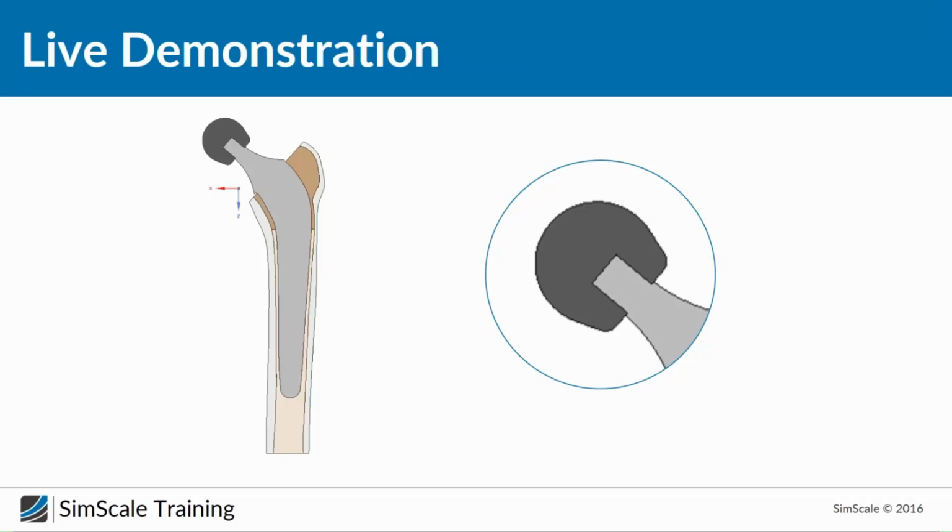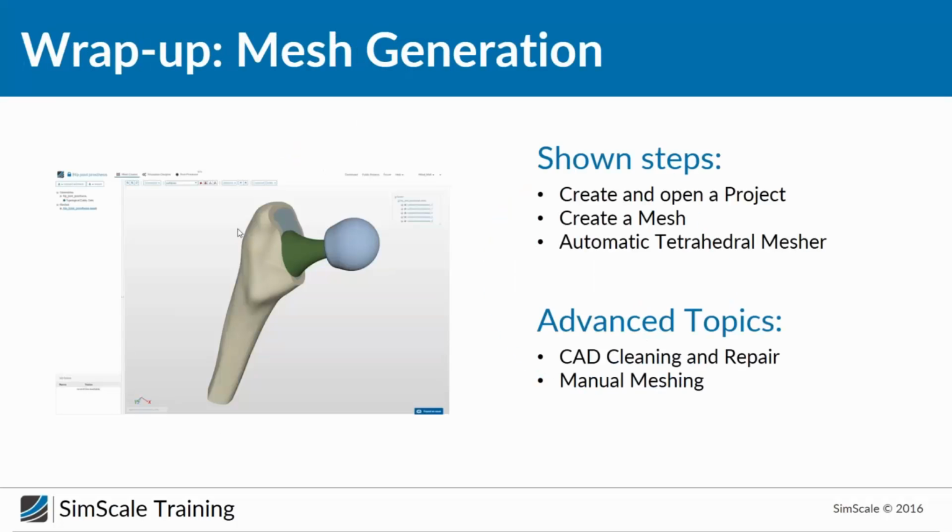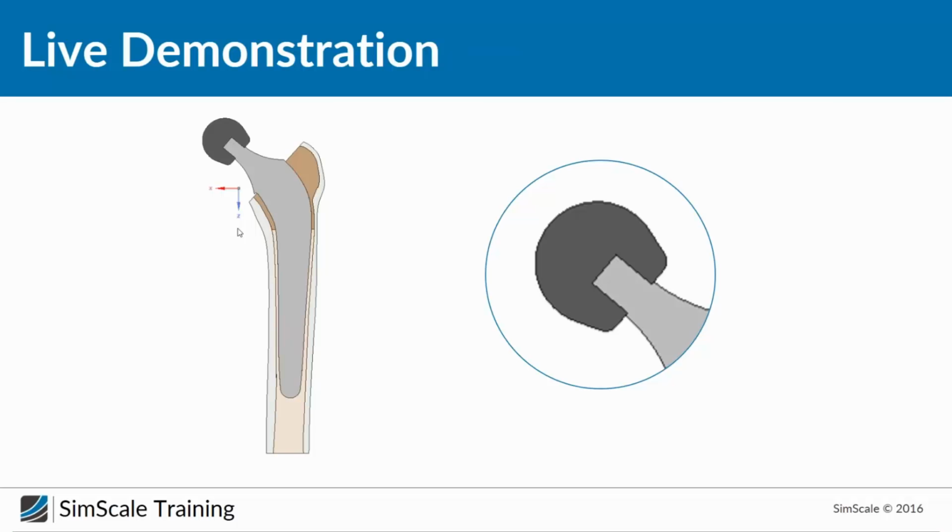Most of the cases not. For example, for all these contacts we made, you could easily change master and slave. The difference between master and slave is that the slave is following the master. So during the simulation, to say it in an easier way, we're calculating the displacement of the master and then how the slave must follow it to make sure the contact still exists. That means, if we take a look at this case, it will not make a big difference if the inner surfaces of the head or the outer surfaces of the stem are the master surface.